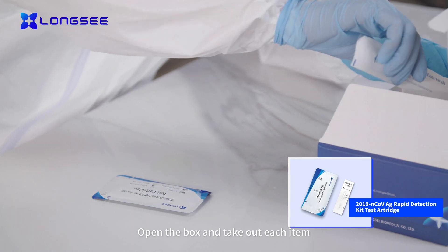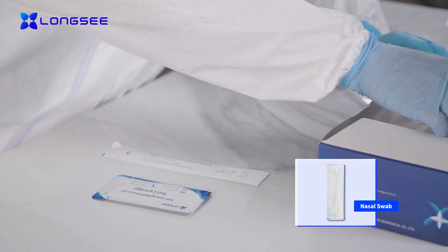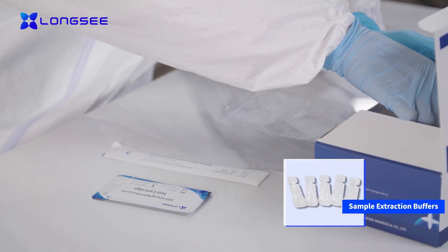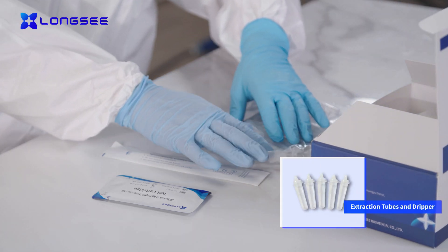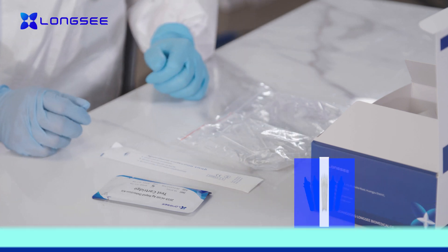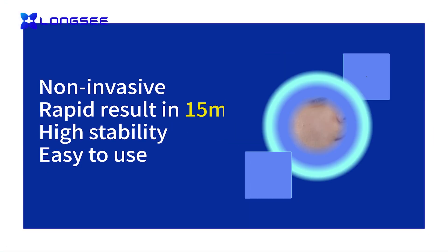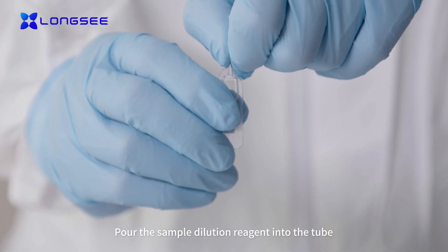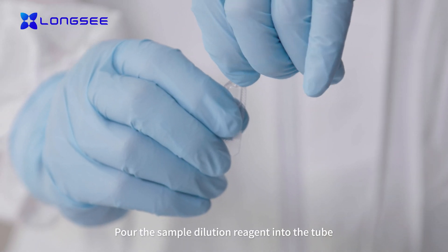Open the box and take out each item. Pour the sample dilution reagent into the tube.